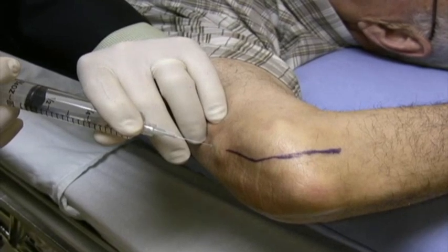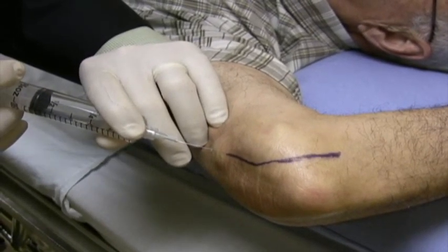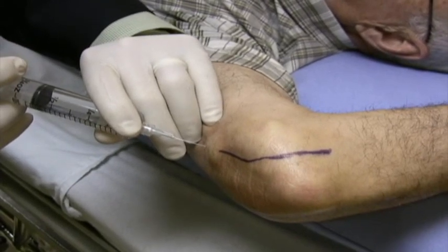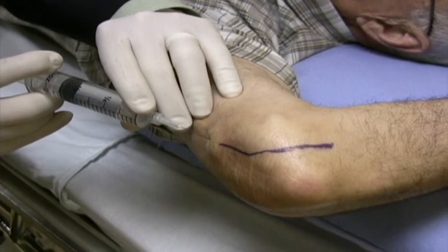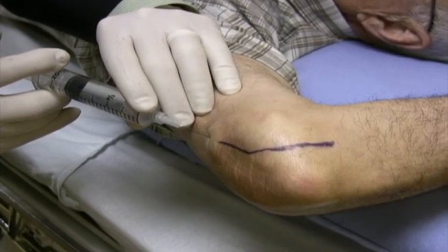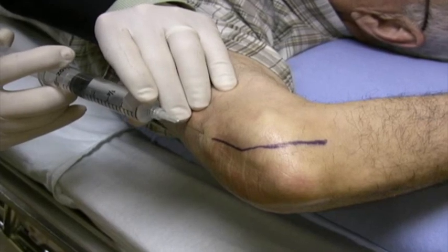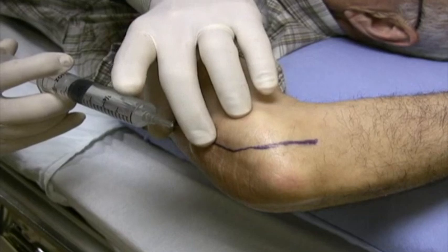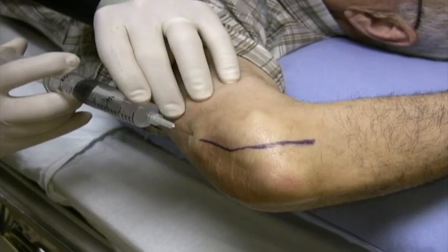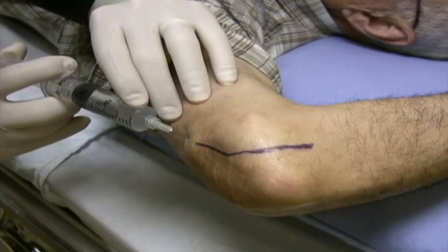So far I've put in about 3 or 4 cc's right there and I haven't moved at all. Has that hurt at all? No. So now I can start moving my needle because I've got a safe zone to work in. And I'm going to re-aim it so that it's just below the dermis. And I'm going to blow slow before you go. That's the whole key.